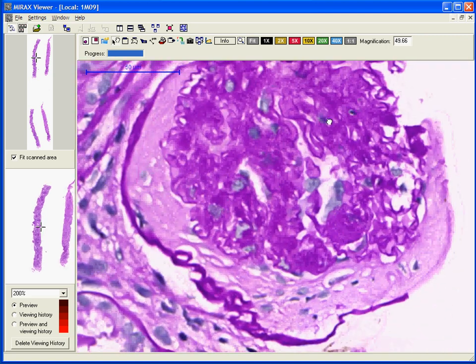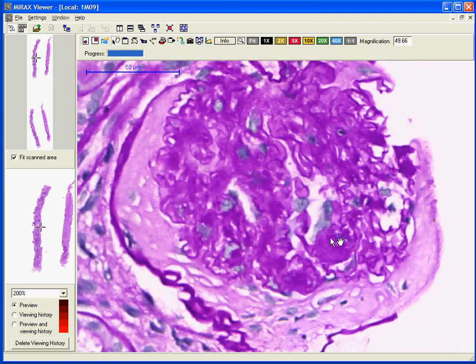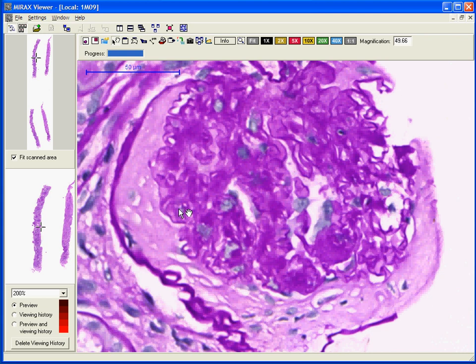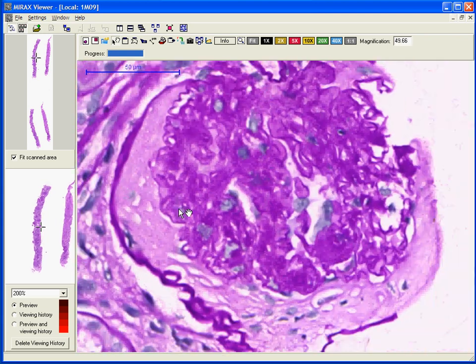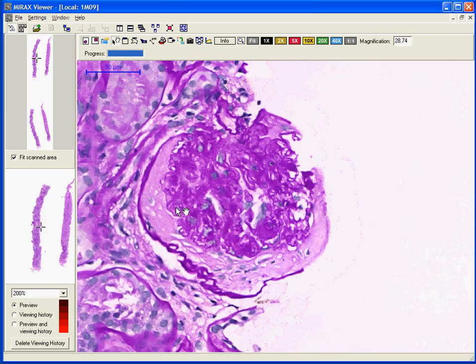This glomerulus shows ischemic changes. It is a sclerotic glomerulus that shows collagen forming inside the Bowman's capsule. This change is commonly found when arterial disease is advanced.